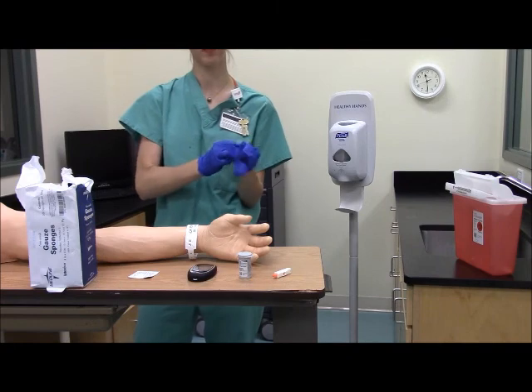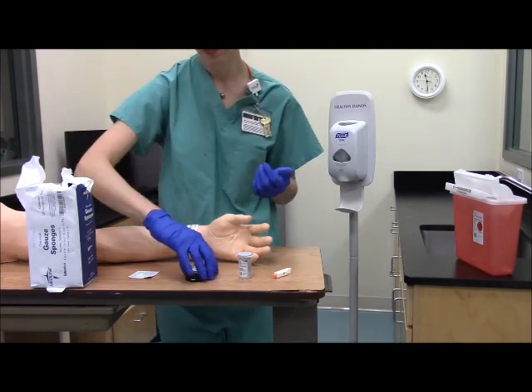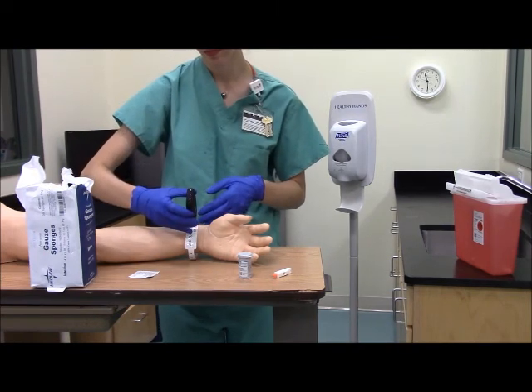We're going to check the ID band on the patient and scan the patient if that's what you do in your facility.